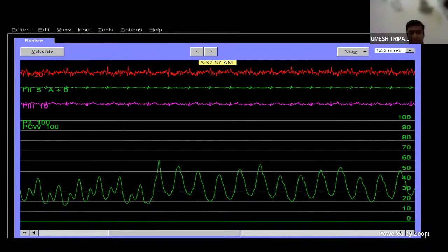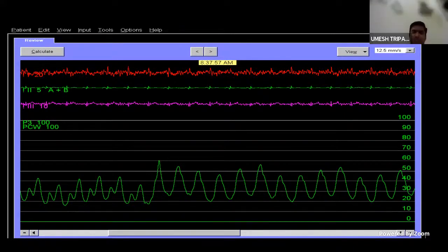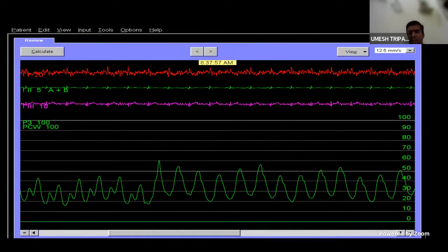The pulmonary artery systolic pressure is 50, and you can say the mean approximately. These are just for discussion. Sir, it will be 35, sir. So it's around moderate PH, sir, that's present. Okay. What is the PA wedge? PA wedge is, sir, also elevated. It most likely can be a case of MS or severe MS or LVD, increased LVD.